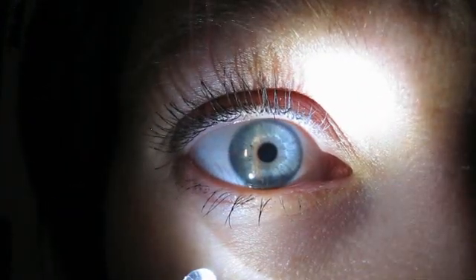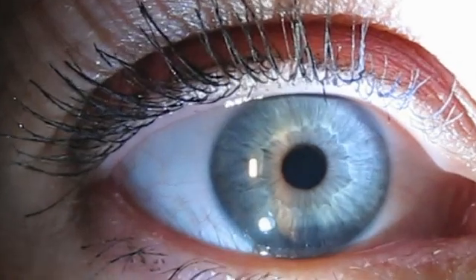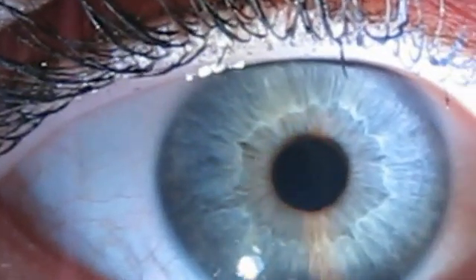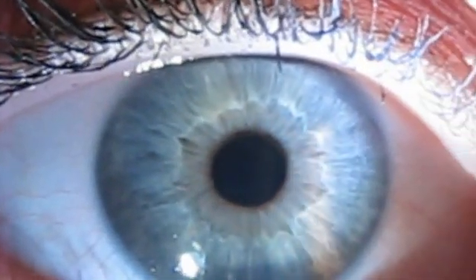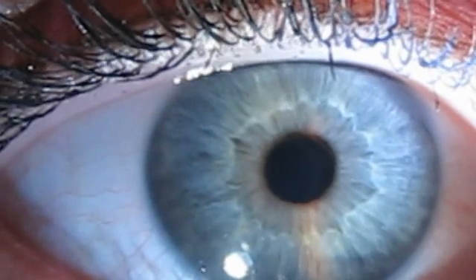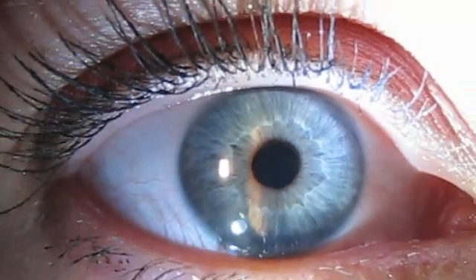Finally, I have included a normal eye demonstrating the addition of the slit beam to a video illuminated by a single LED light.